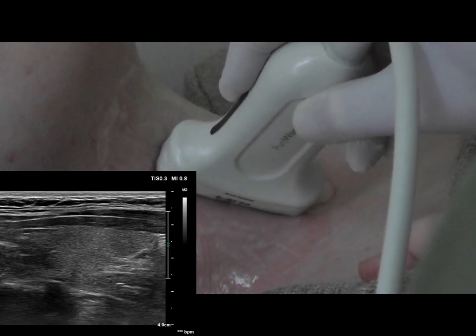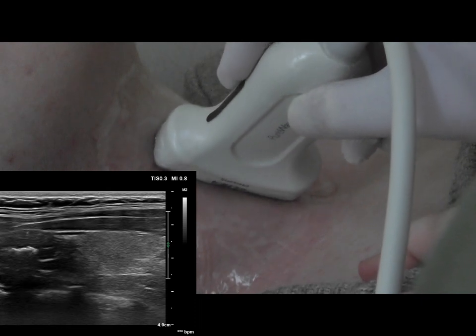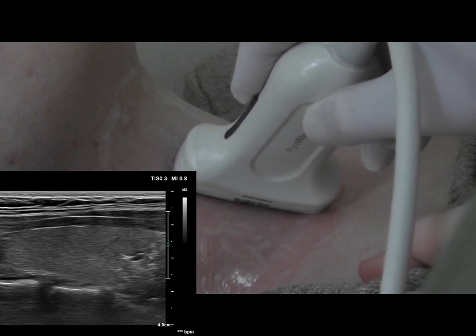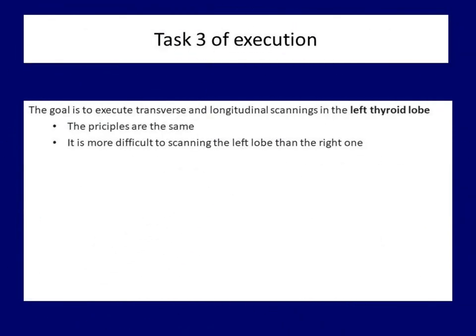Meanwhile, look at the monitor to detect when the thyroid tissue appears — repeat this several times, starting at the upper third, then the middle third, then the lower third of the lobe. If you can safely find the right lobe of the thyroid gland in longitudinal section while looking at the monitor all the way, you may move on to phase three: examining the left lobe. The principles are the same, only the difficulty level is higher.